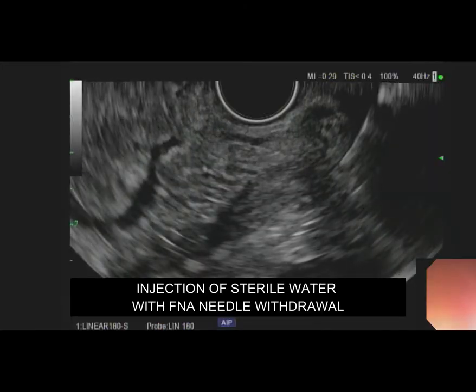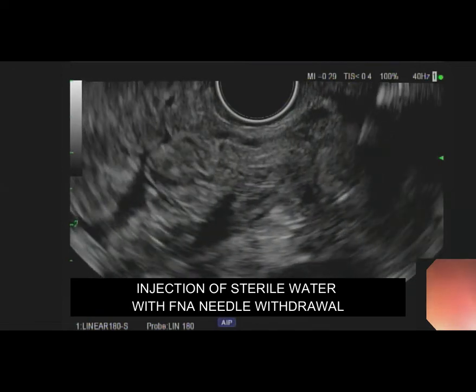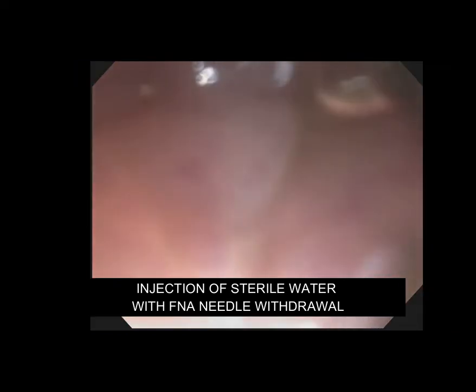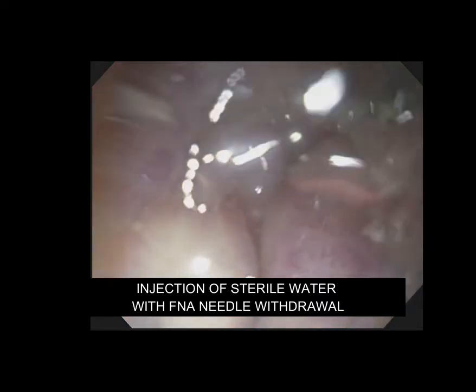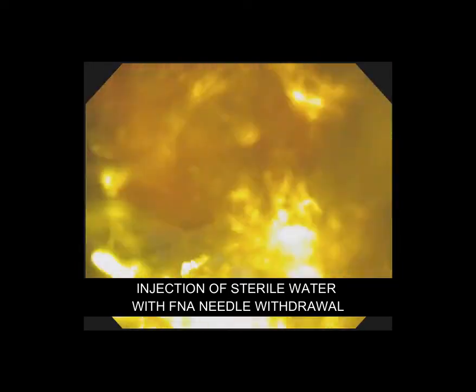Upon completion of injection of the cyanoacrylate glue, careful withdrawal of the 22-gauge needle was performed with simultaneous flushing with sterile water. This is done to prevent clogging within the scope, as well as the formation of a glue cast which can rupture and cause recurrent bleeding.